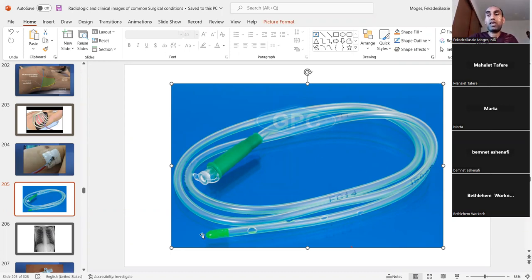All right. Sometimes it is not as easy as talking like this. Sometimes the patient might be choking. Reason being, if you don't go into the esophagus, rather if you go into the trachea, how do you know whether you are intubating the trachea or the esophagus? How do you know clinically? How do you know, guys?